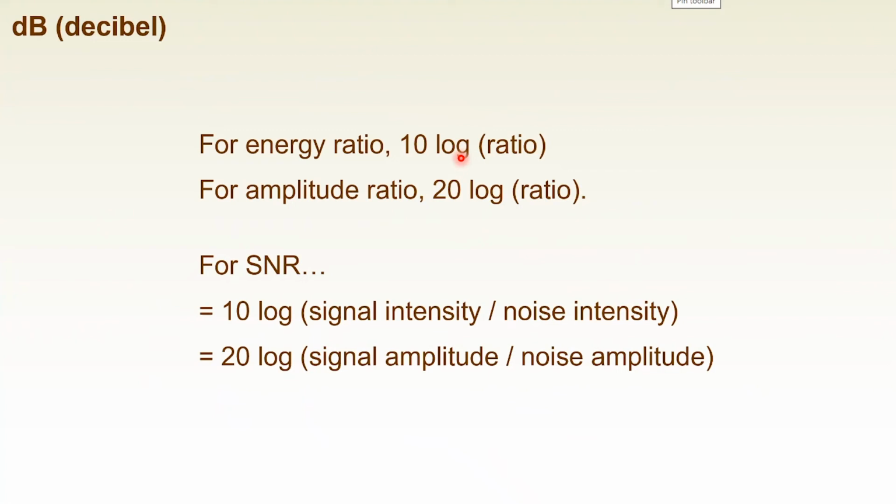It is always defined by the ratio of the energy. If you use the amplitude ratio, you should compute it as 20 log 10, and it is exactly the same as the energy ratio. So there is no ambiguity. Let me exemplify this a little bit.